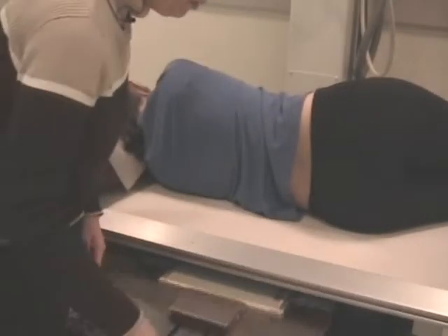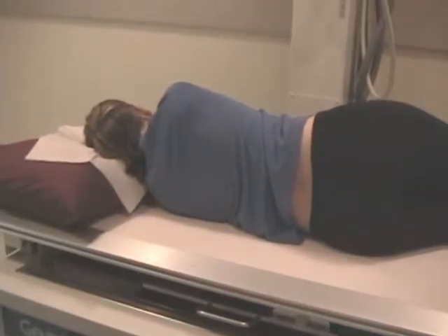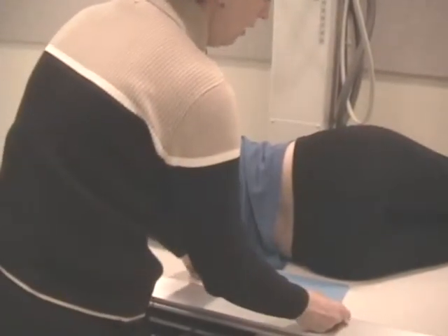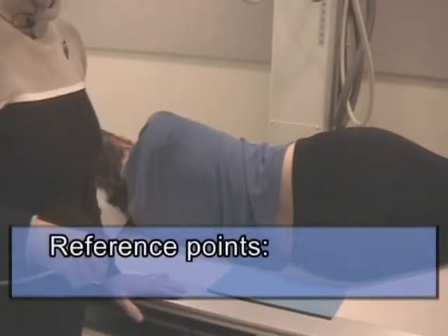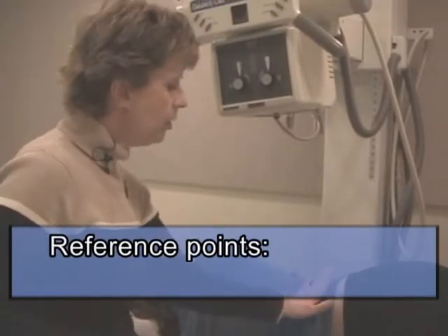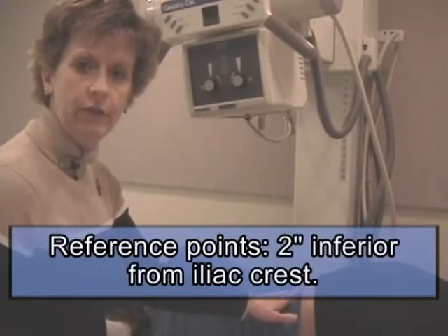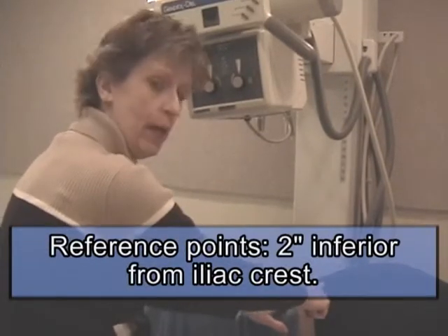Once I have my tube and my film lined up, I can push the bucky tray in and then ignore it from this point on. You are still going to have a lot of scatter production, so I use that lead blocker behind the patient again. The reference points now for the center of the film: you find the iliac crest, and you need to go 2 inches inferior to the crest. So here's the crest. I'm going to go 2 inches from that point.